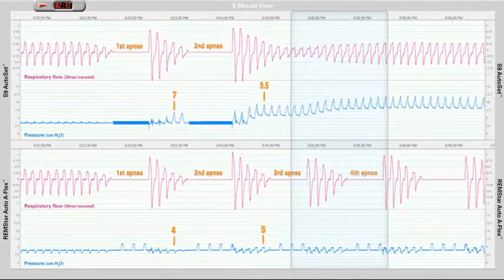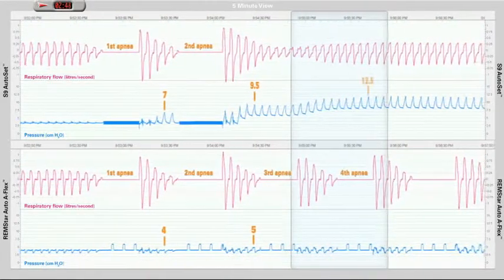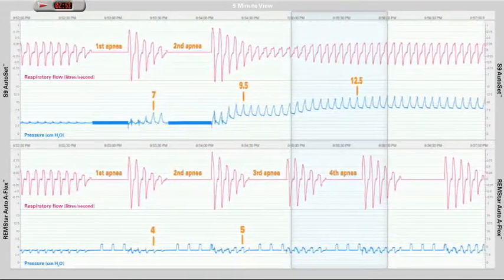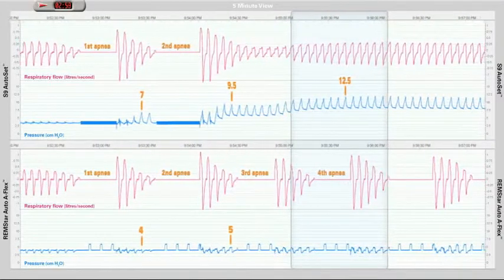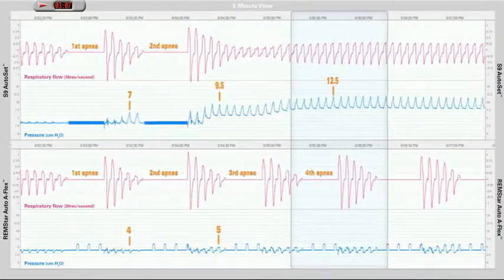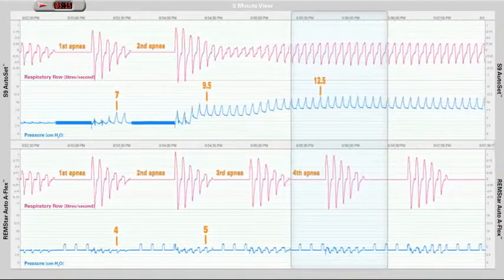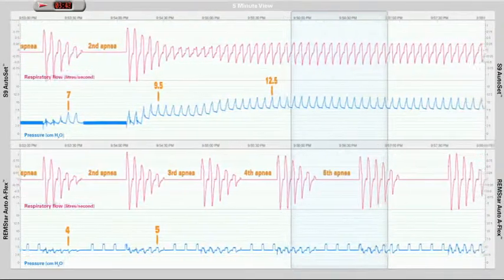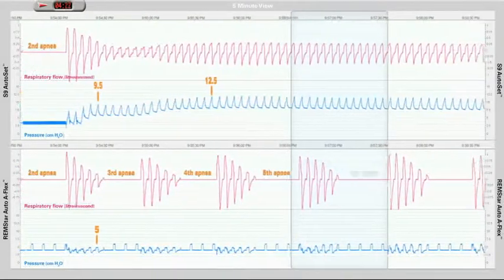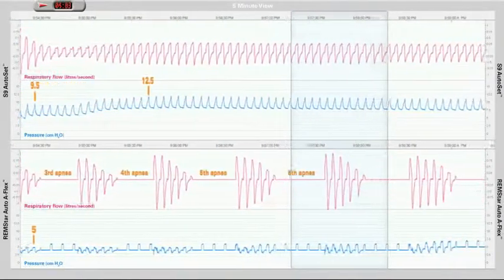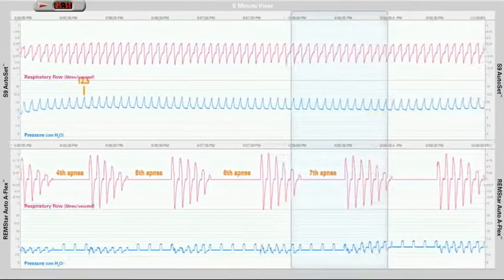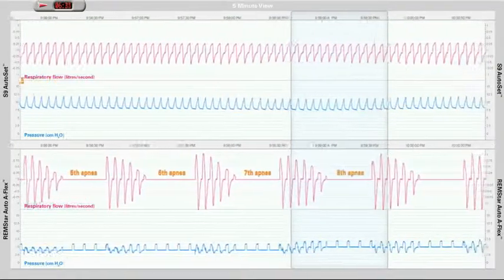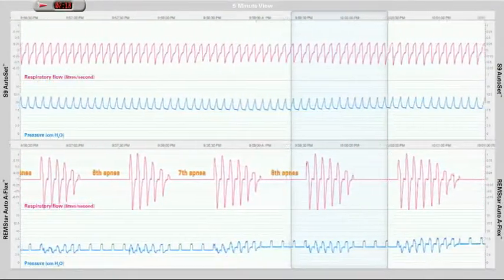The S9 Autoset has achieved a stable airway with a treatment pressure of approximately 12.5 cm within 3 minutes. The Remstar Auto patient suffers a fifth apnea. The S9 Autoset continues to monitor the patient's breath shape on a breath-by-breath basis and adjust the pressure to maintain a stable upper airway.